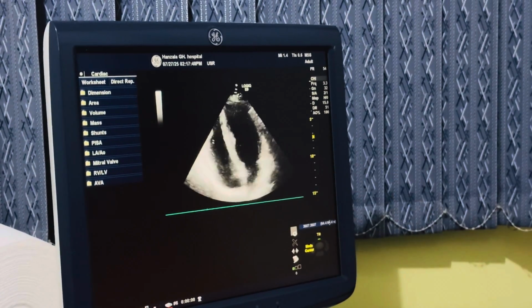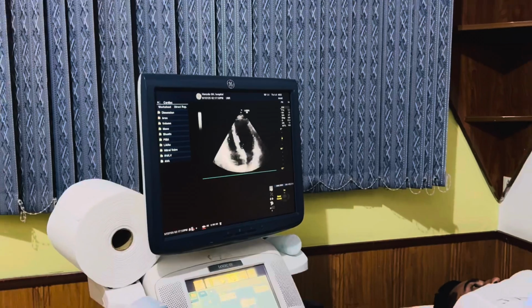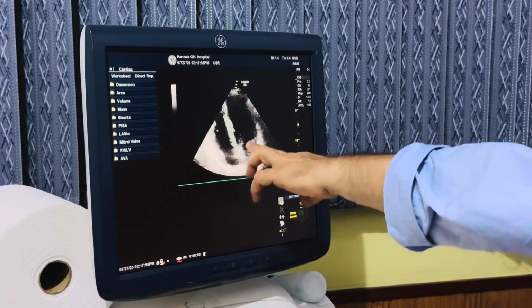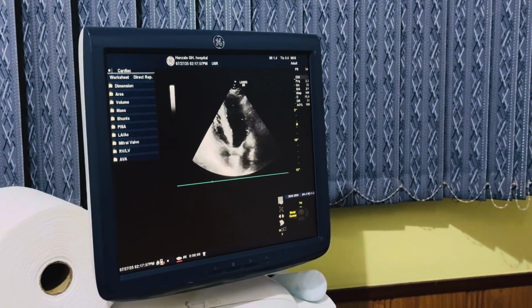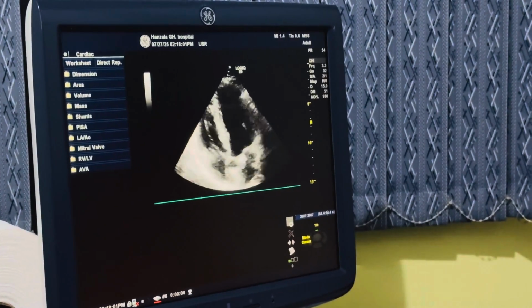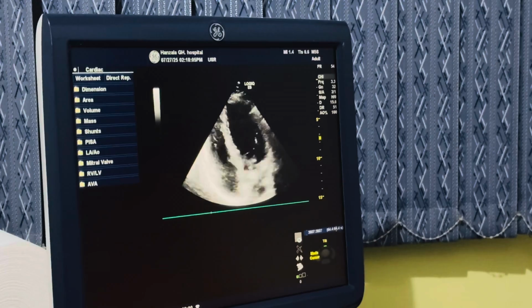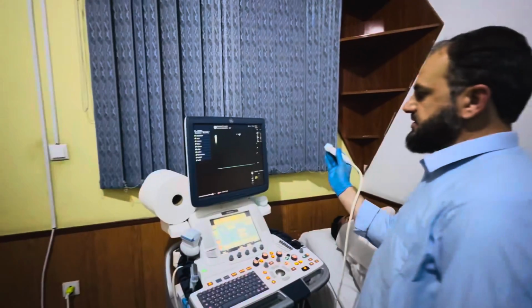So to see all, this is 4 chamber view. Now, like as I mentioned earlier, if you want to see the 5th chamber, there is no 5th chamber, but we are opening the aorta. Look at here, aorta is opening, right? That is the aorta. Now it's considered a 5 chamber. 1, 2, 3, 4, 5. Now, what I did, I just tilted the probe a little superior.